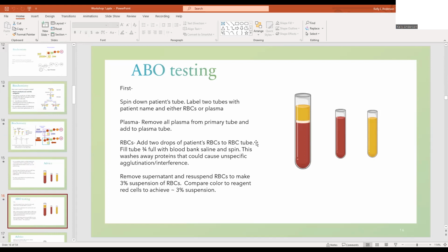So for centers that use DIN flags, every single sticker on that DIN pad will have a different ID or DIN flag. What's the first word you're saying? The kind of flag? DIN, EIN? Donor identification number, DIN. Okay, thank you.